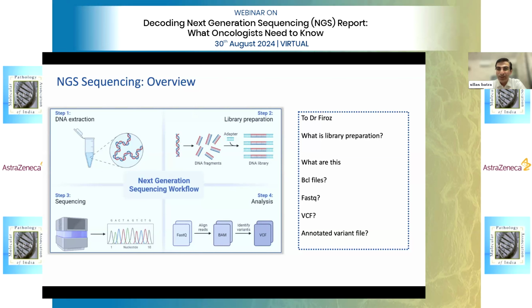Okay, go ahead. So now we have fragmented and amplified the DNA. Then what happens? QC check done. If everything goes well, technically on day 5 the library preparation will start. A library is whatever you have extracted, whether DNA or RNA, fragmented. If it is amplicon based, you use certain primers to target the hotspot, say for example EGFR exon 19. You amplify only those regions and remove the other regions. If it is capture based like Illumina, you use the probe base.